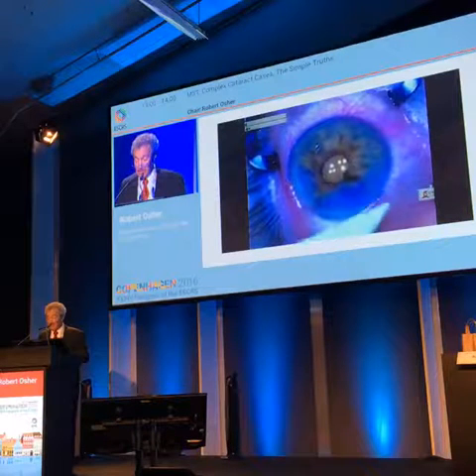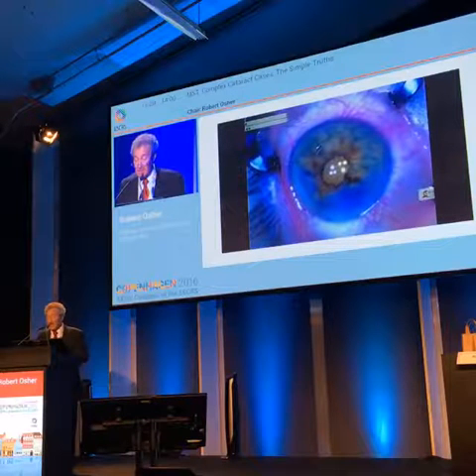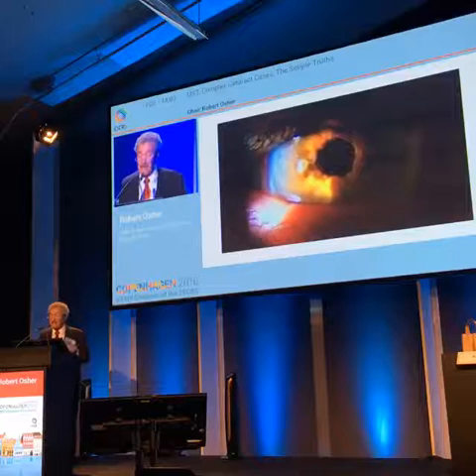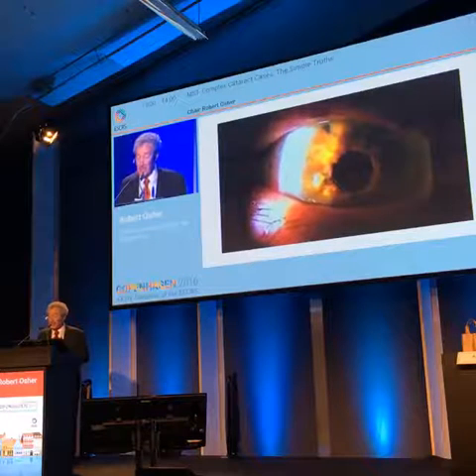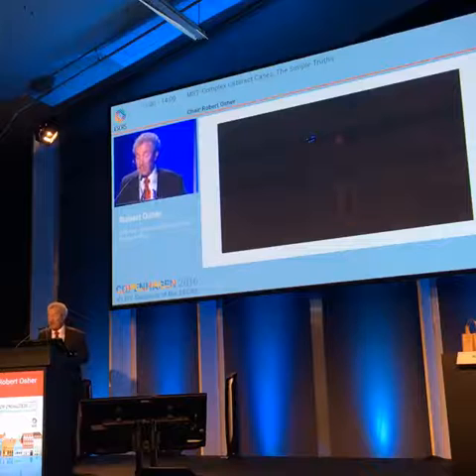You can see the synechii. I press on the incision. And this was about a year and a half ago. And again, I see this pupil is notched. Many times the pupil doesn't even look operated, but this was a bad iris with synechiolysis, peripupillary membranectomy.